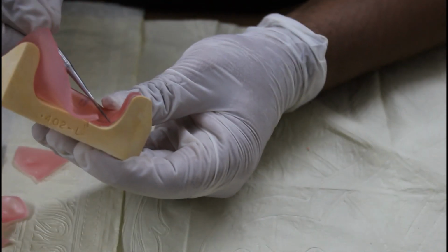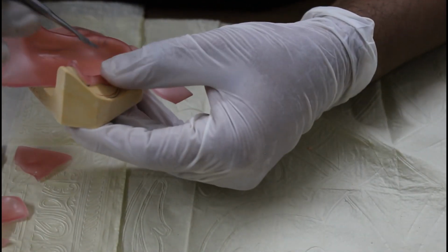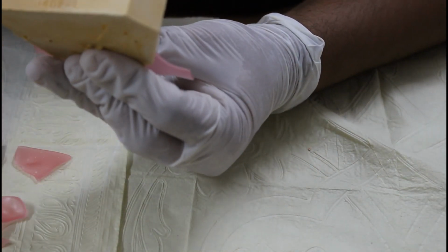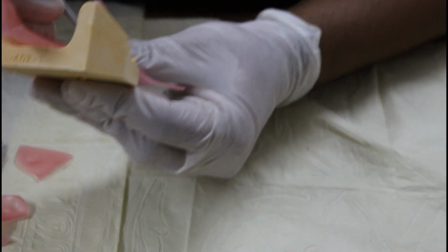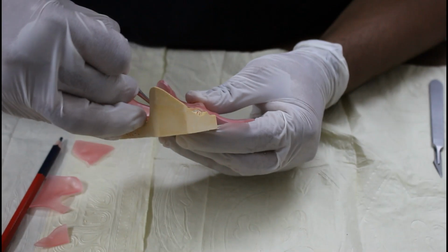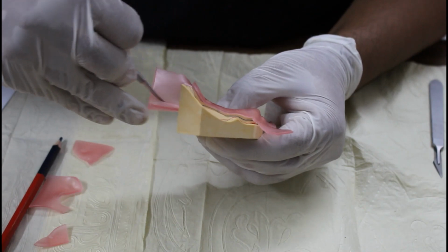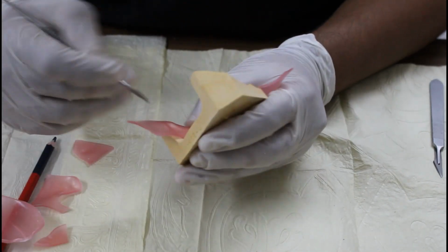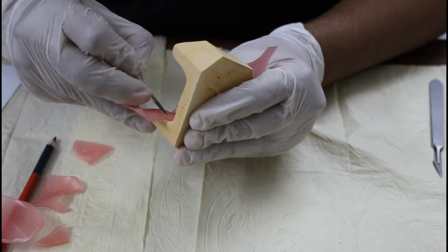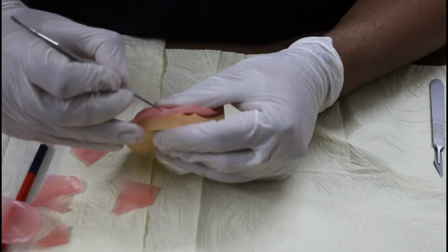Till your blue line, you have to cut it. This is how you have to cut.